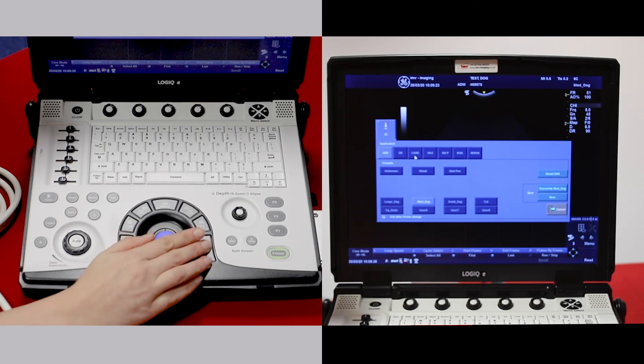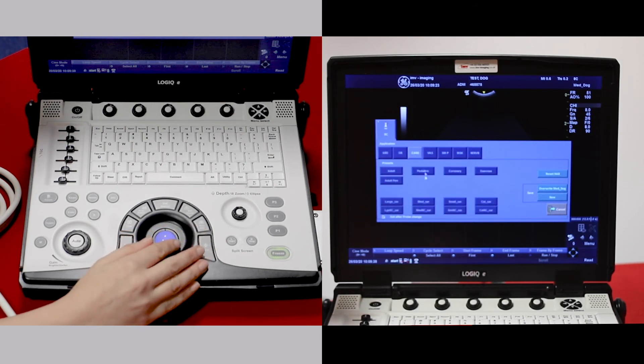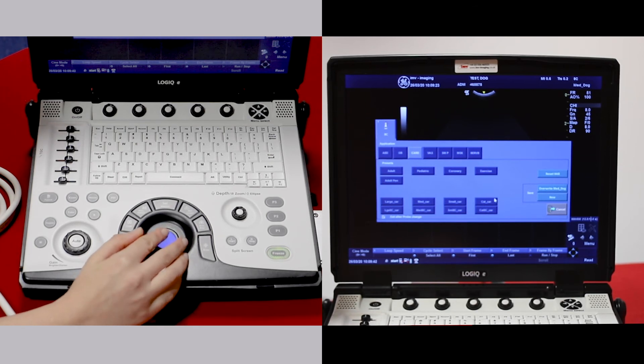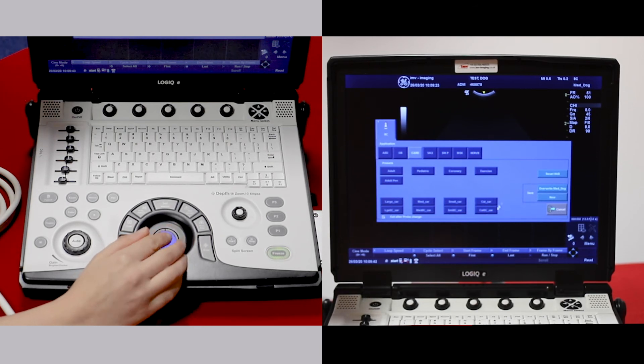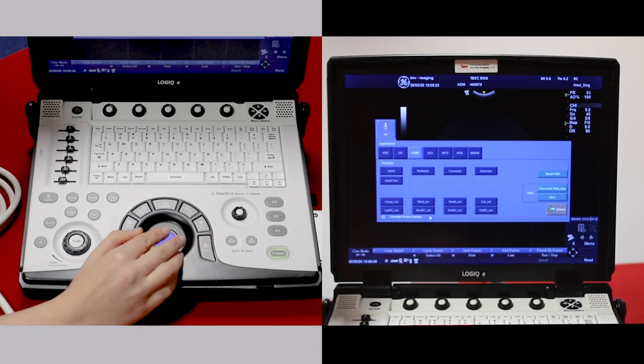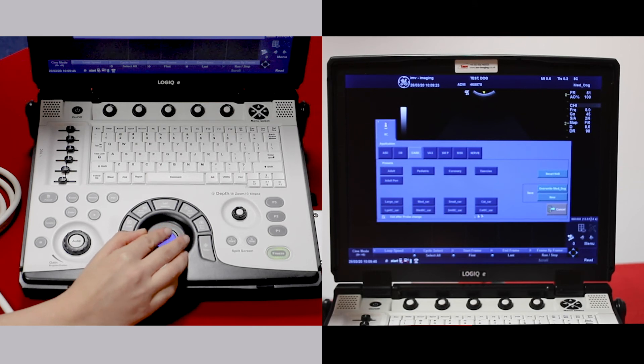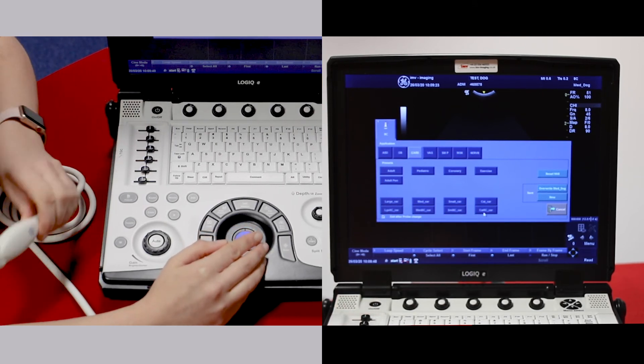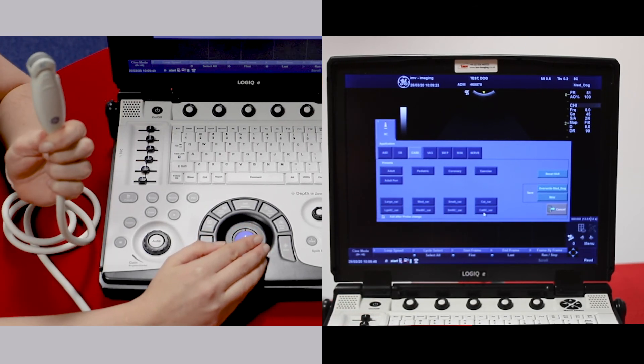In cardiac, the first row of presets are for the cardiac probe. The second row of presets are cardiac settings for the microconvex probe, the 8c.